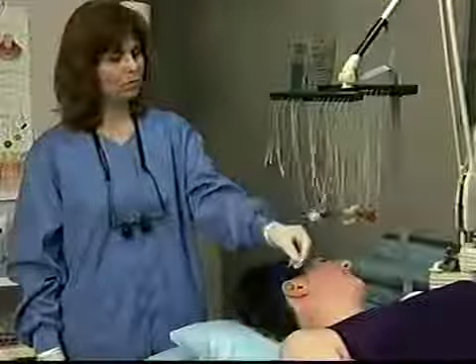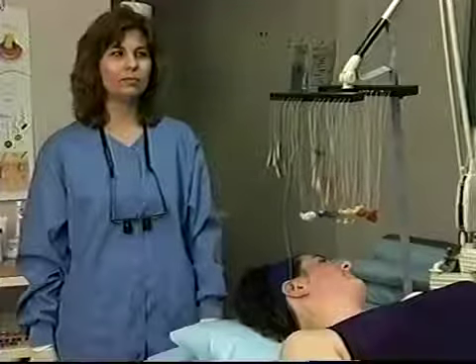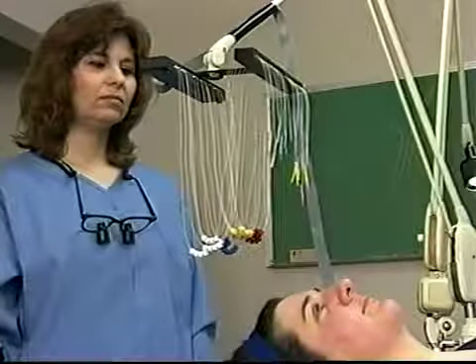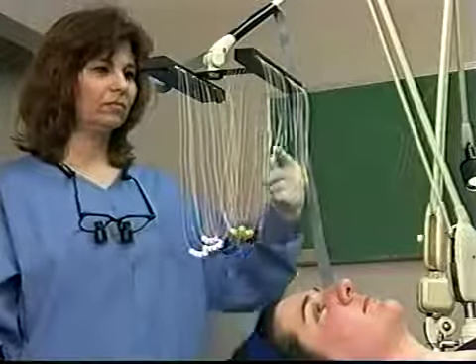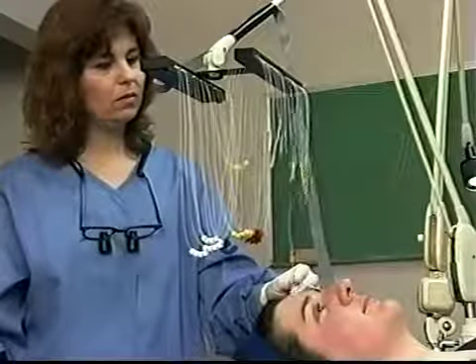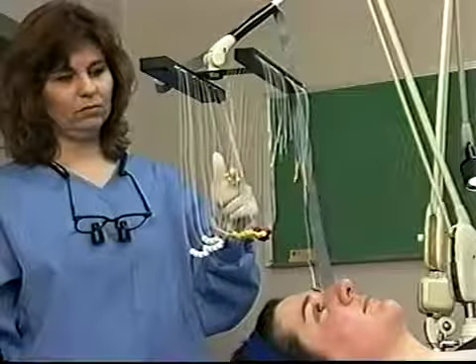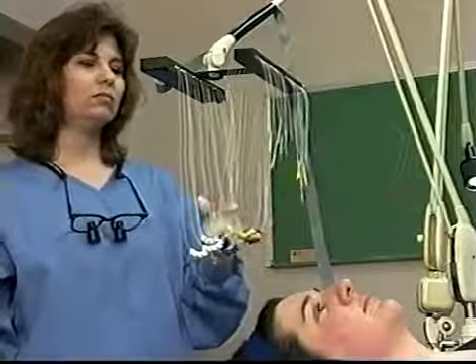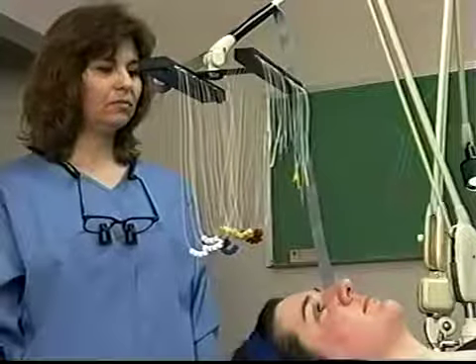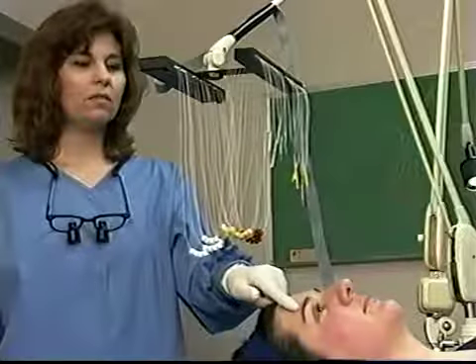For the left ear, I generally position the patient's head at the other end of the table and set the rack in a comparable position. When doing the eyebrows, it is important to prevent accidental eye contact with the needles. Position the rack so that it is slightly above the eyebrows. This way, if the needles accidentally slide out, gravity will pull it away from the eye area. Now see, if this needle is released, the cord moves over the forehead. Don't try to do both eyebrows at the same time. I generally divide the area into 3 sections: the left eyebrow, the glabella, and the right eyebrow.